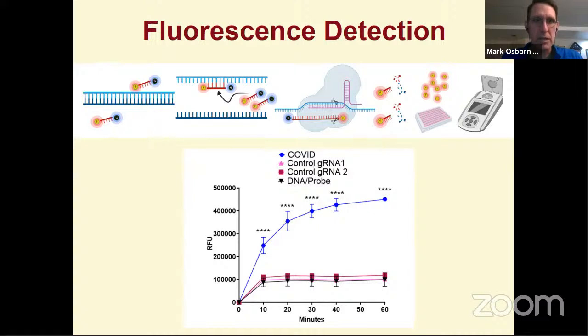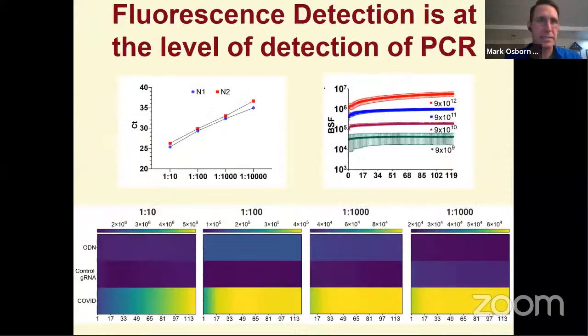And so we use this with Cas9 nuclease rather than the biotinylated nuclease inactive version. We use the nuclease properties of Cas9 and then used two different control guide RNAs that are mismatched to the COVID-19 target. And then when we had a matched COVID-19 guide RNA, it allowed for robust fluorescence activation. And it was differentiated in a statistically significant fashion in about 10 minutes. And so it streamlined both the throughput as well as sensitivity and speed with which we could perform these assays.